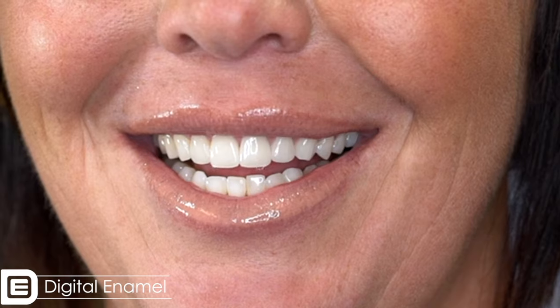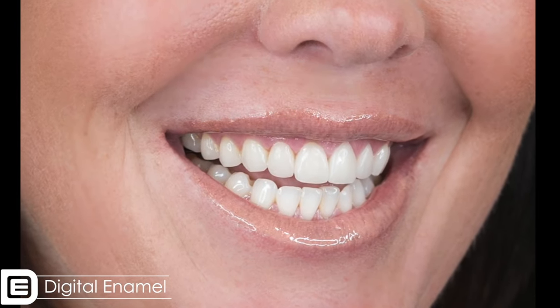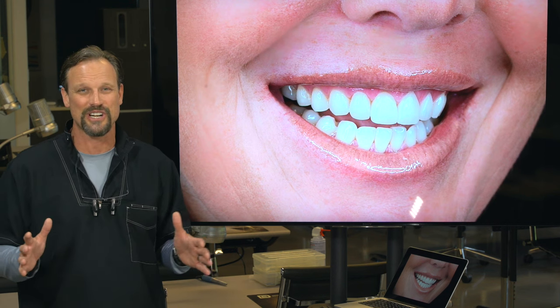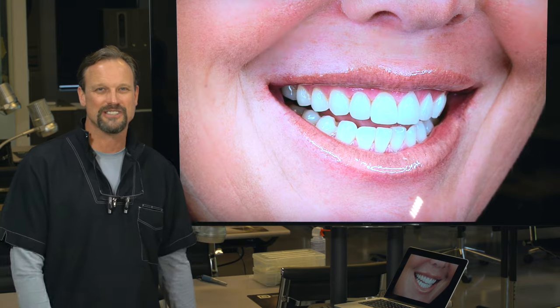We had Lori come in a week later just to do a bite check and see how her gum tissue had healed — she looked excellent. We were really happy with the step from the centrals to the laterals — a gullwing effect, as some people like to call it. I think we did a great job with the contouring of the gingiva. When it comes to cosmetic work, it's the little things that matter most. To do a veneer case in one visit while reducing your stress, you've got to have everything lined up. We cover that in our one-day crash course for CEREC veneers — come down to Austin and see us at Digital Enamel.